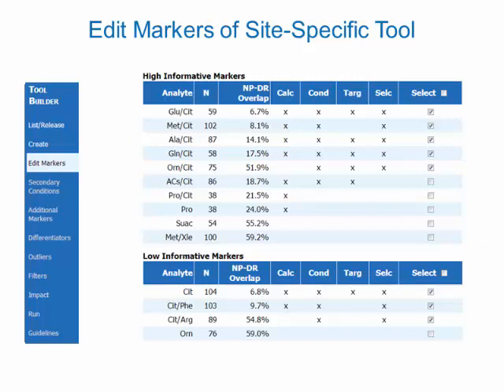In the Edit Marker page, high and low markers are listed in separate tables. The columns of these tables are, from left to right, the name of a marker, the count of results available in the database, and the degree of overlap between reference and disease range. 4 other columns summarize additional attributes of a marker and will not be discussed in detail here. If desired, a complete explanation is accessible in the documentation menu of the R4S website, section Presentations.